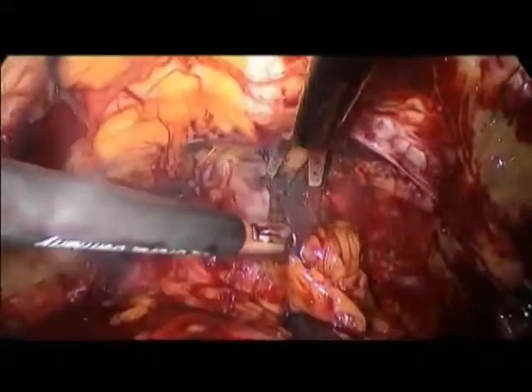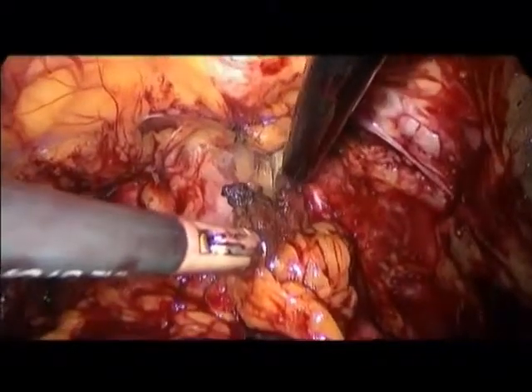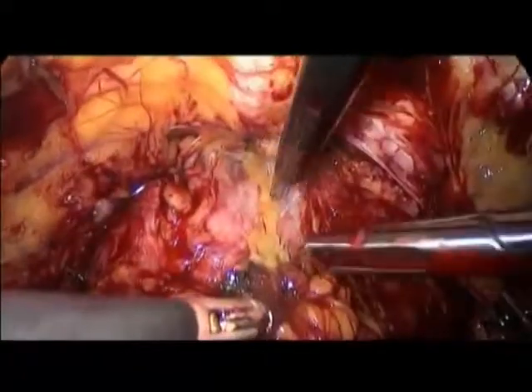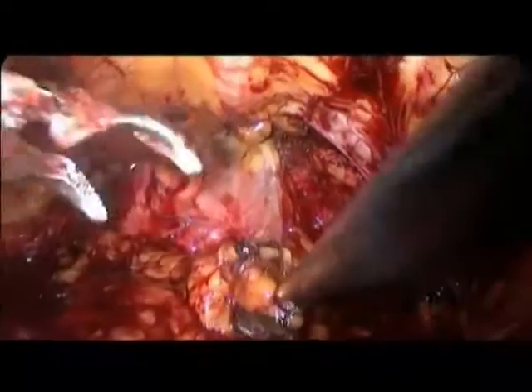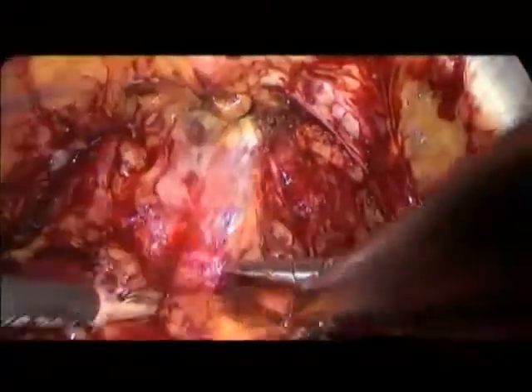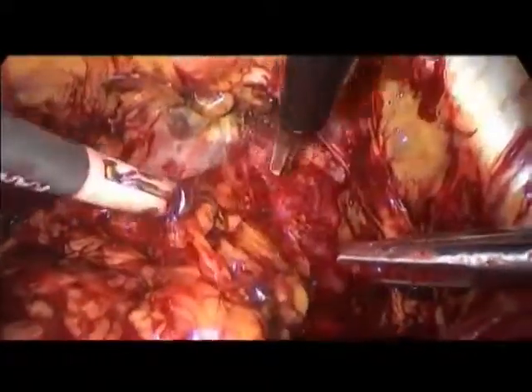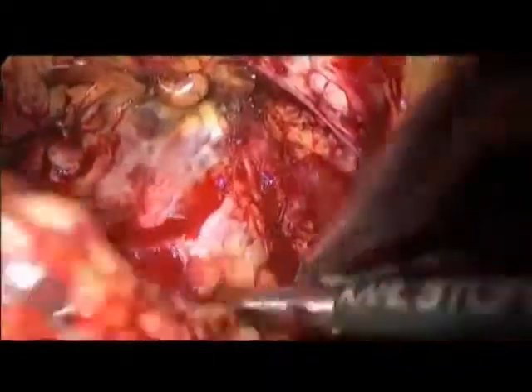And getting this fat free from the anterior aspect of the prostate is interesting not only for the vision on the prostate itself, but also, when pulling this fatty flap cranially, it helps to define the bladder neck, because this is the place where this fat becomes more adherent to the anterior aspects of the bladder.